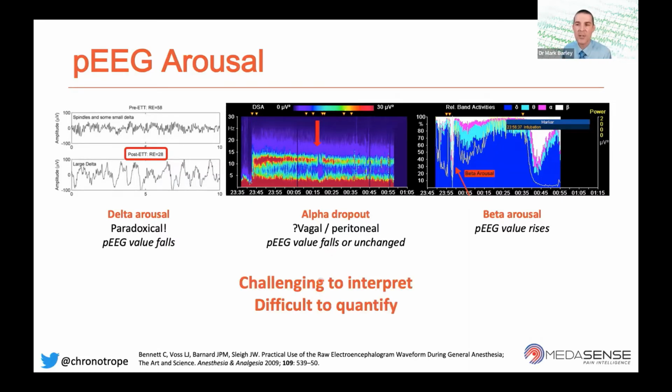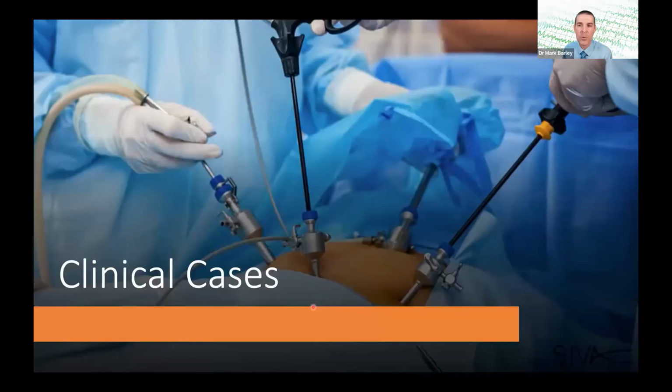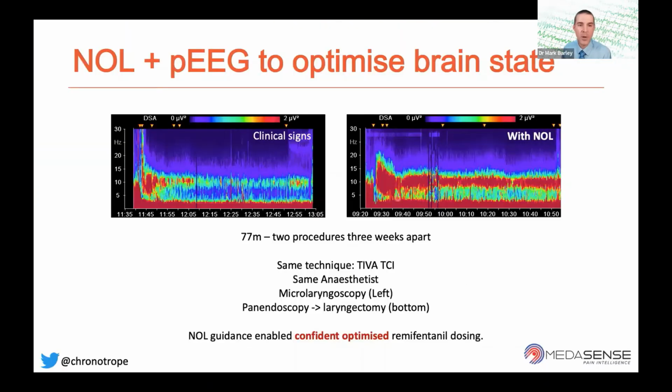But these are challenging to interpret and difficult to quantify, and this is where a nociceptive monitor can be really very helpful. So let's whiz through some clinical cases. This is a gentleman whom I had the privilege to anesthetize twice, just three weeks apart, once using my clinical acumen and once using my nociceptive monitor.